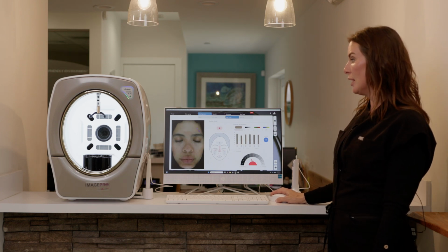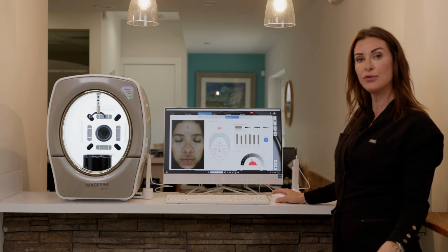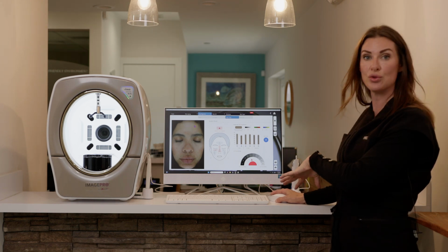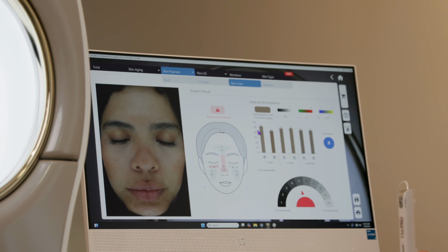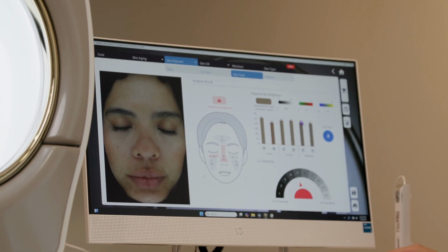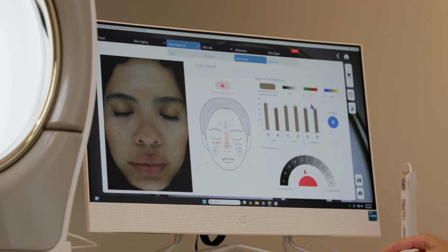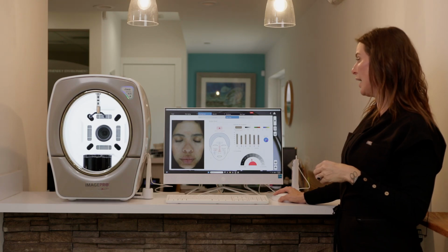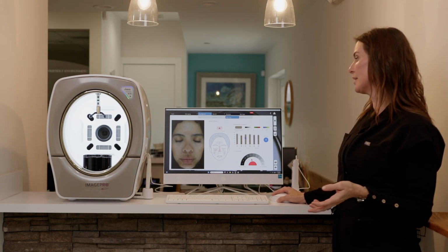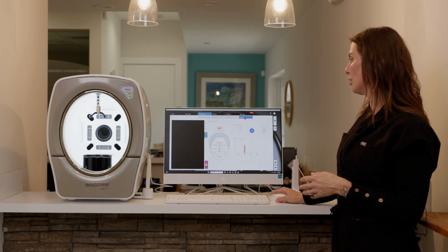Skin tone. This is the image that you're most often going to use for your actual before and after photos, simply because this is what they're used to seeing in the mirror. This is their natural skin tone. These little indicators right here, as long as they're very close together, meaning that her tonal appearance is very congruent. In this case, she's 8 better off than those of her average age group. If there was a lot of variation in this, that would mean there's dark darks and light lights on the skin, and it would be an issue.